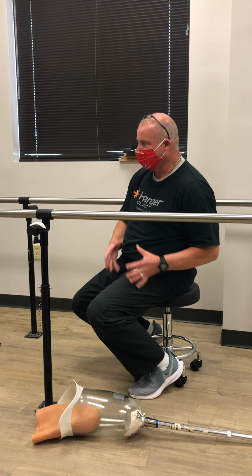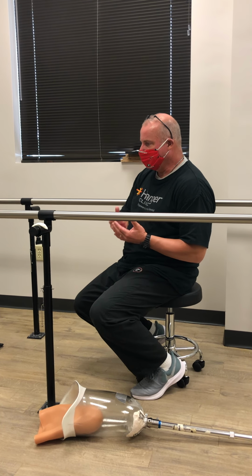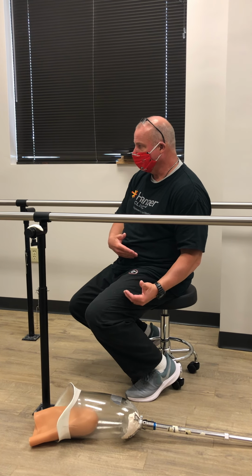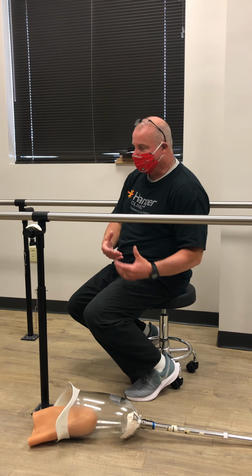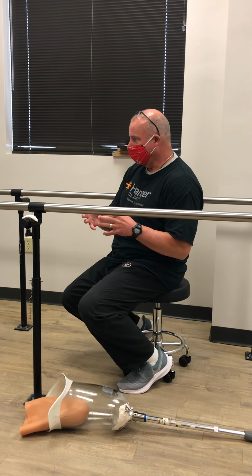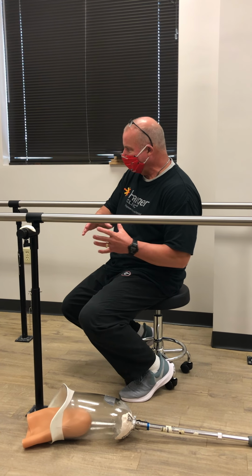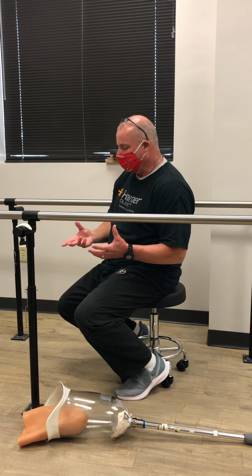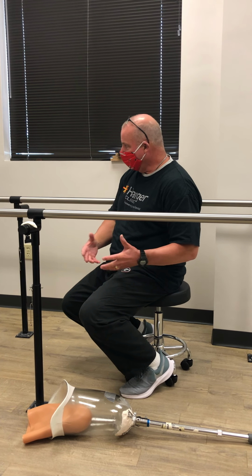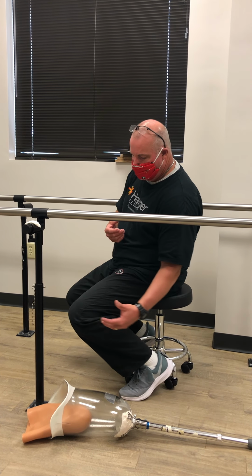It's snug. A prosthetic socket, you want it to have an intimate fit. If it's loose, you're prone to get sores from shear forces. You're also potentially going to be more unstable. If it doesn't move when you move, that's not a good thing. There's lag time, there's bouncing around. We call it bell clapping when the socket gets big and you start moving your limb in and out. Your control is gone.